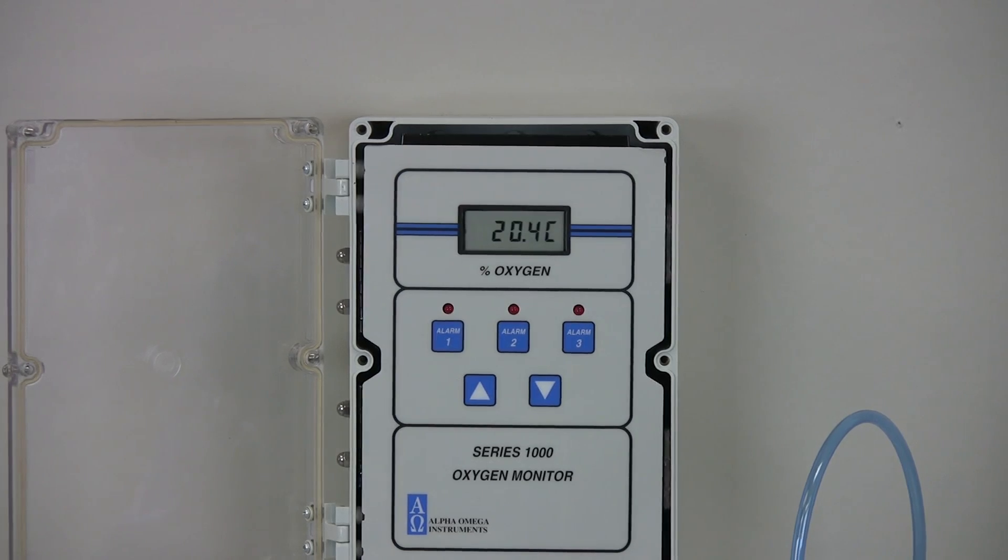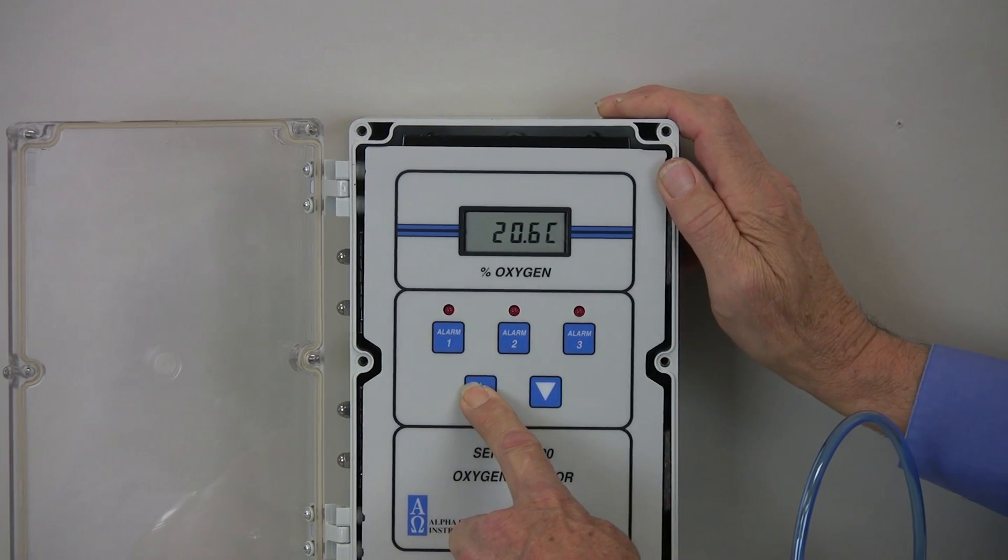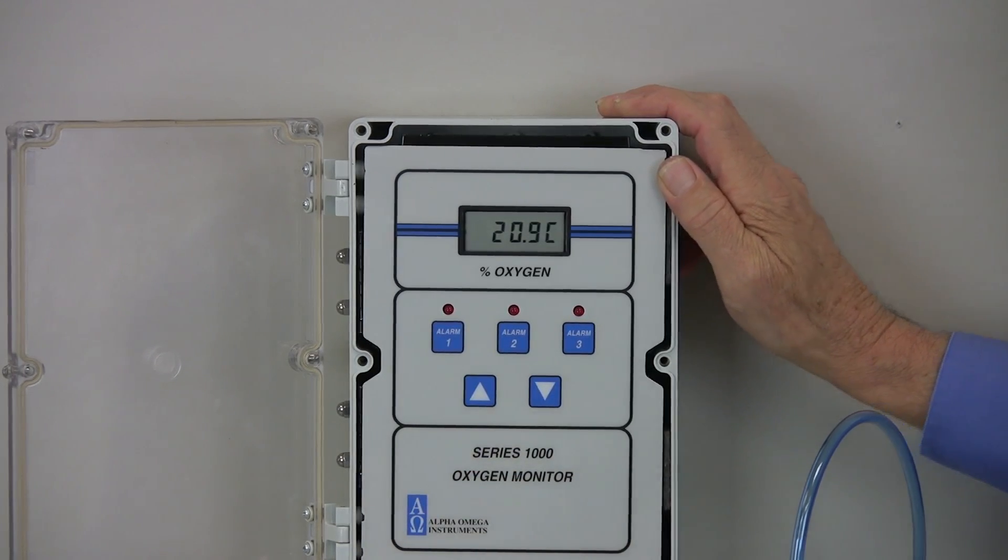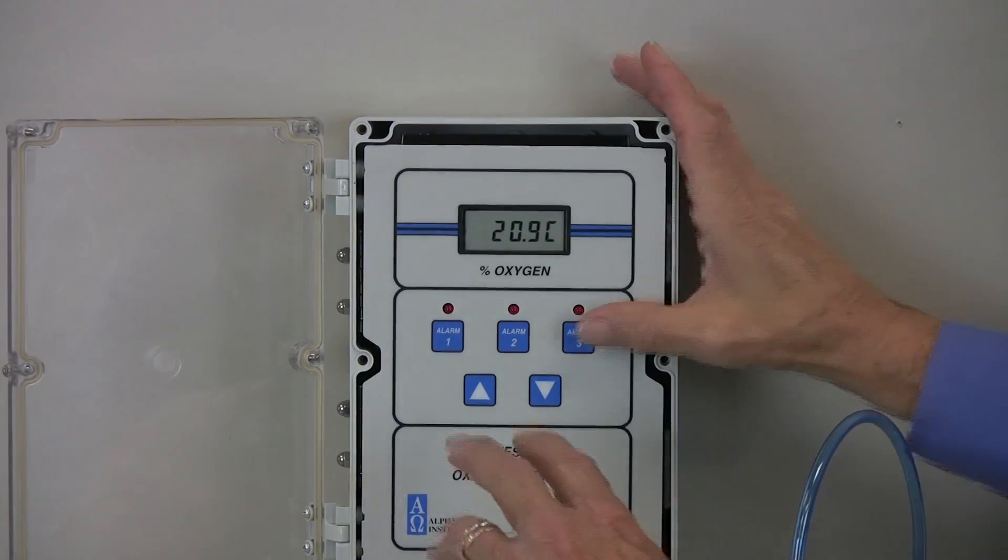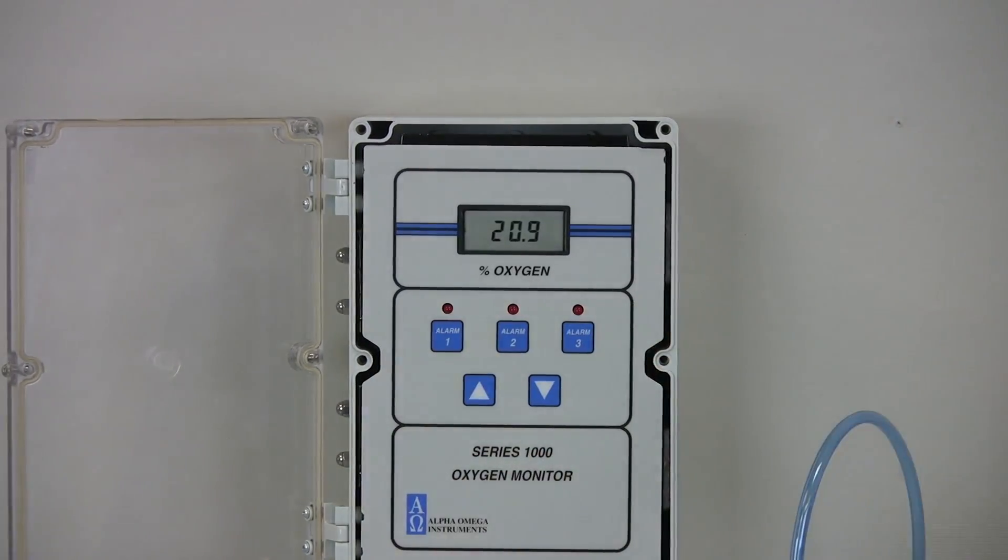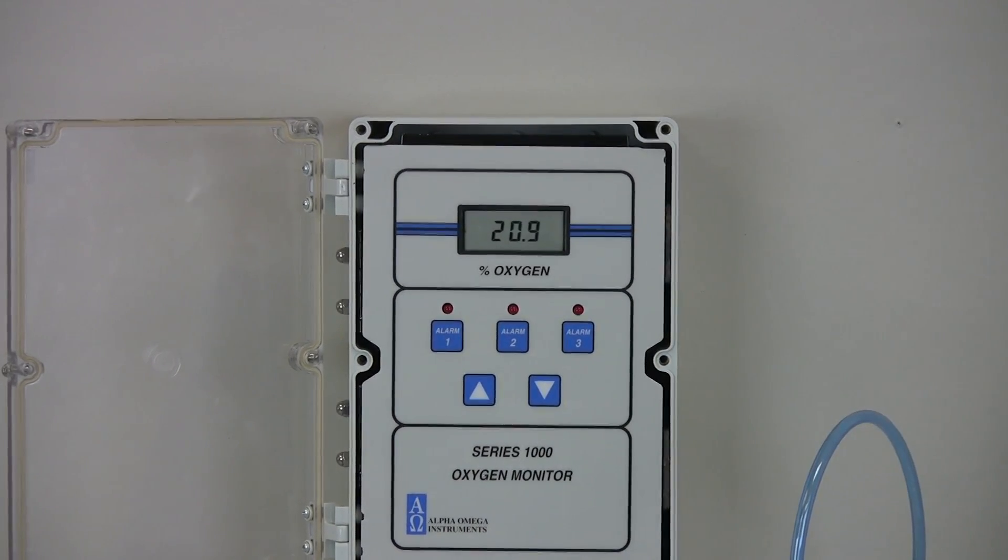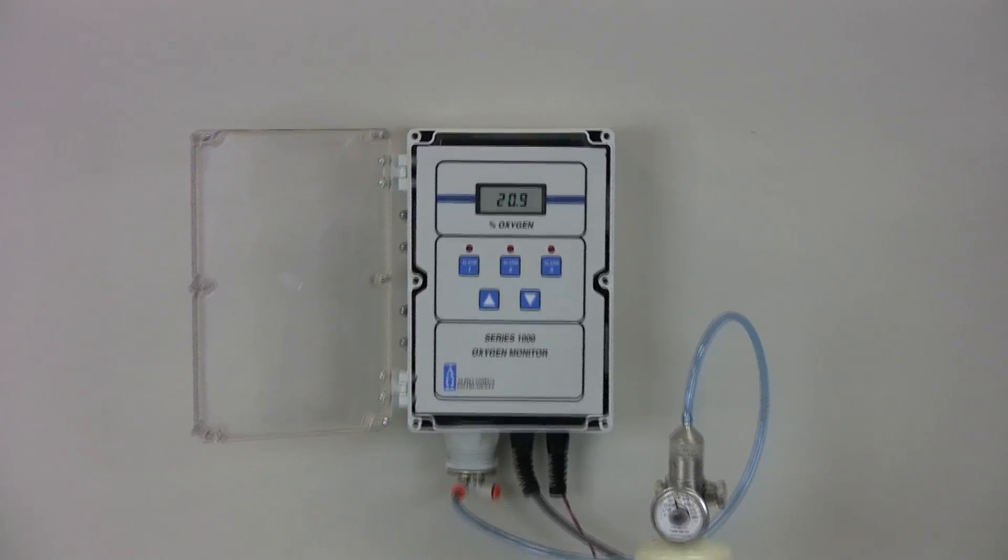Next, use the up arrow or down arrow buttons as needed to adjust the readout to 20.9%. Now, simultaneously press alarm buttons 1, 2, and 3 again. The letter C disappears. Your monitor is now fully calibrated and displays 20.9%.